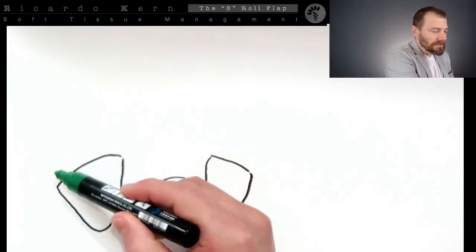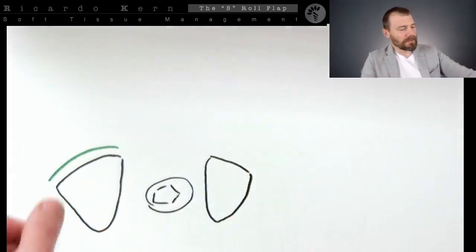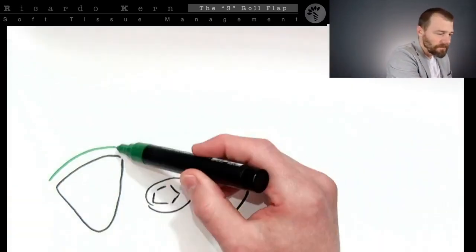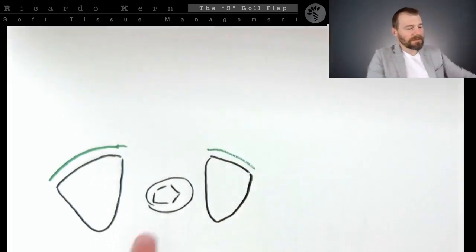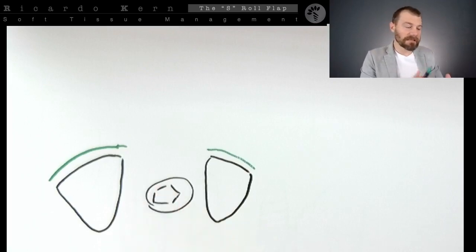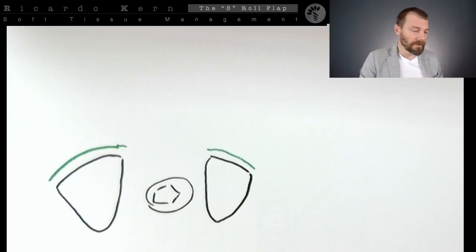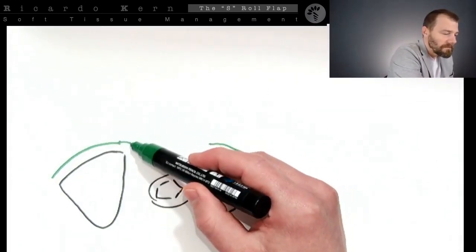What you have on this crown here, you have the volume all preserved because you have the bone preserved here because of the presence of the natural crown and root, so the soft tissue is preserved. Okay, and here all the same. What you have on this area here that had an immediate implant some years ago, problem, without filling the gap with biomaterial and without any connective tissue graft to augment the thickness of the buccal area. You have some collapse of the tissue.